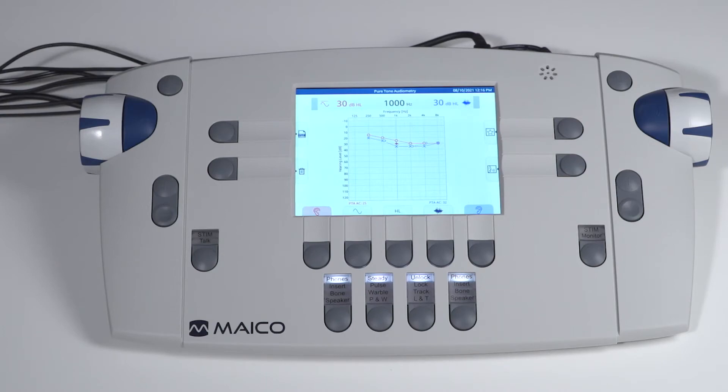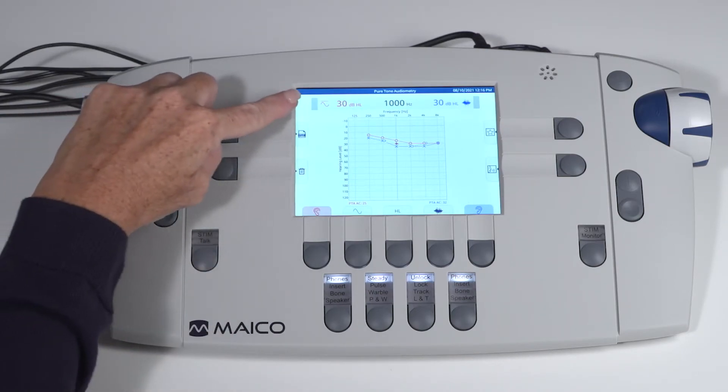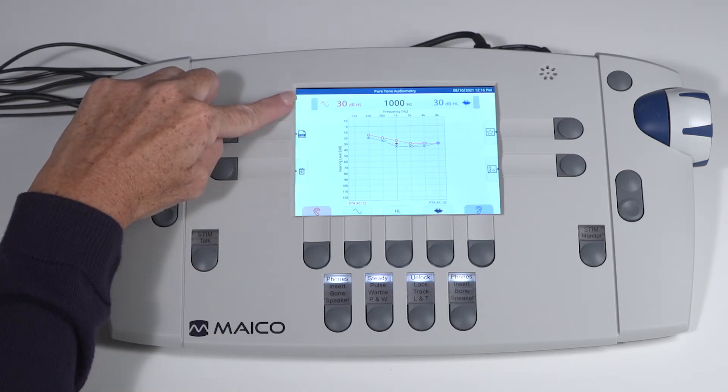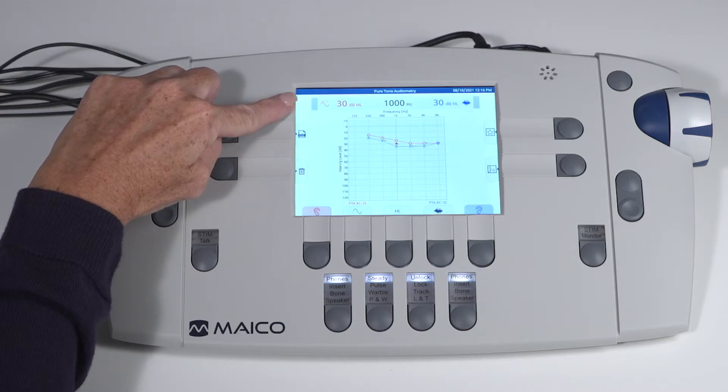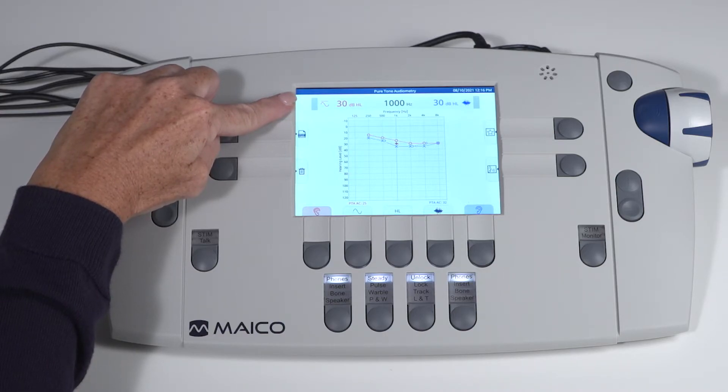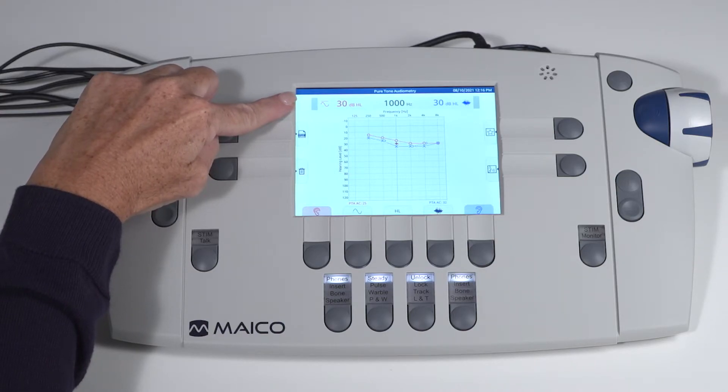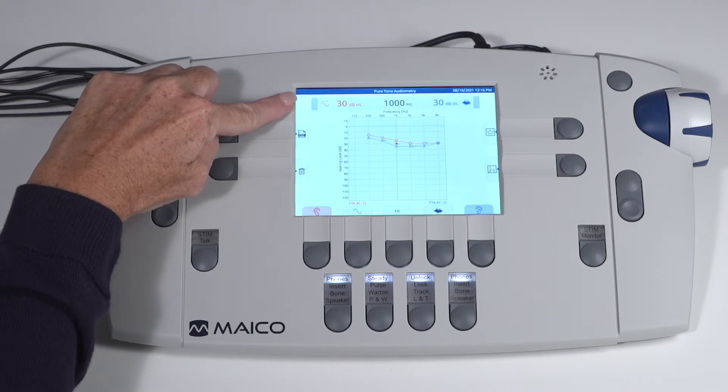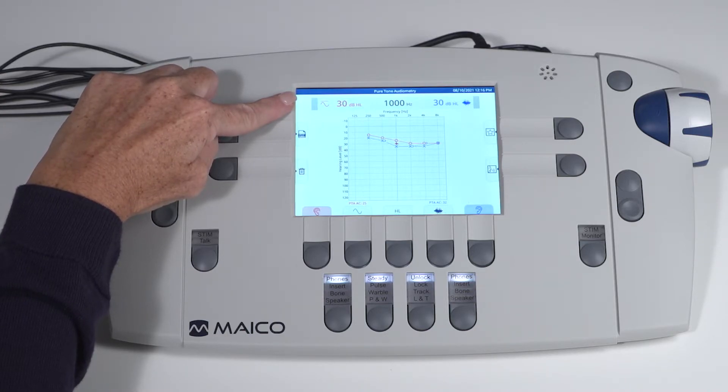Test status can be easily identified by the status bar at the top of the screen with the level and frequency, as well as the test signal routed to each channel. Red or blue lettering indicates routing to the right or left ears. Stored thresholds are displayed on the audiogram.